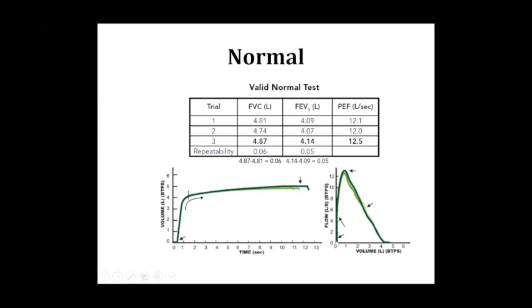For the flow volume loop, it's the same as the subject starts from zero without hesitation or poor effort or cough, and he exhales until he reaches the peak, peak expiratory flow. Then mid-expiratory flows appear very well and very intact without any scooping or any reduction in their value, which is indicative of airway obstruction. So this is a normal flow volume loop and volume time curve.